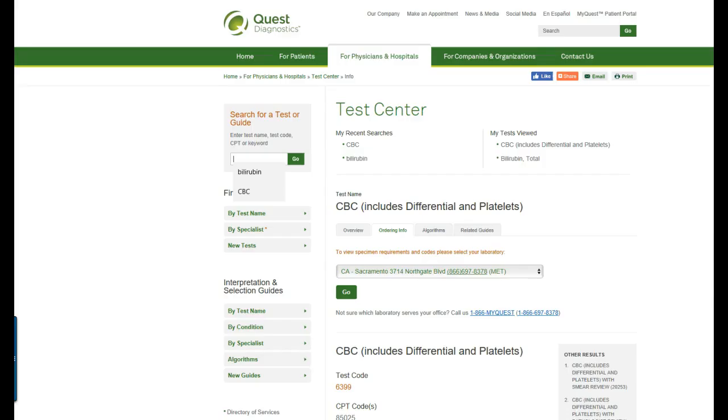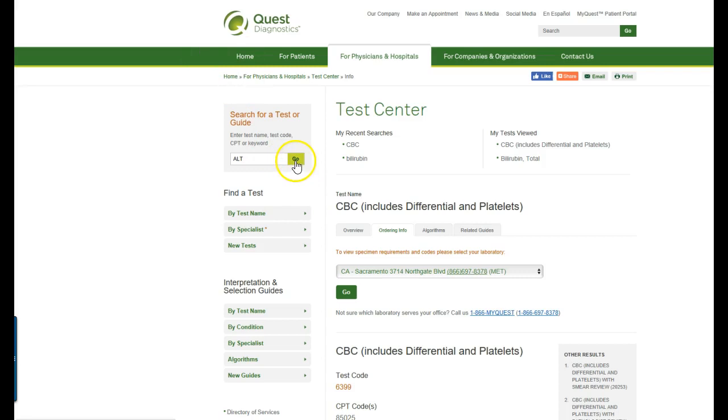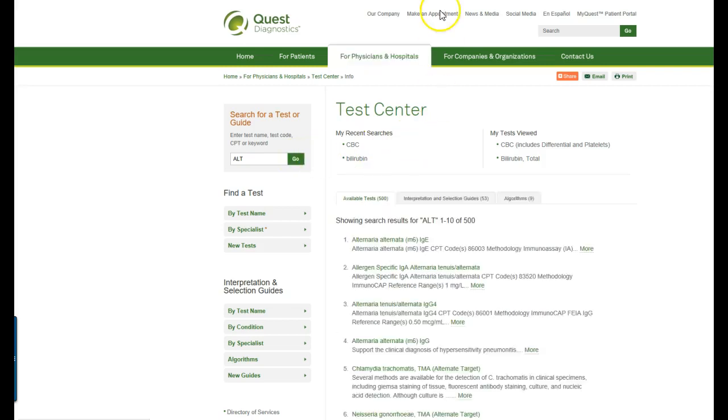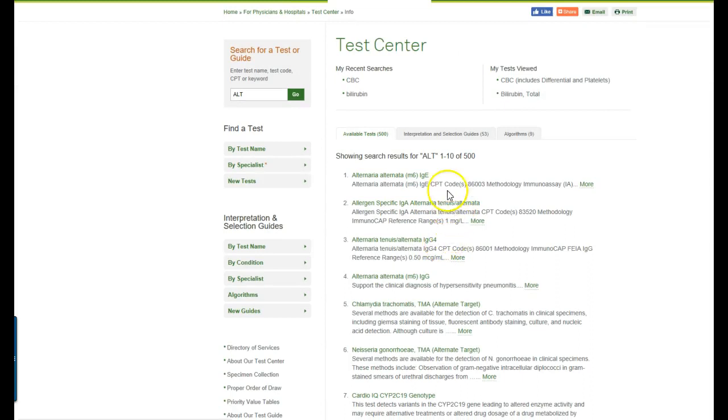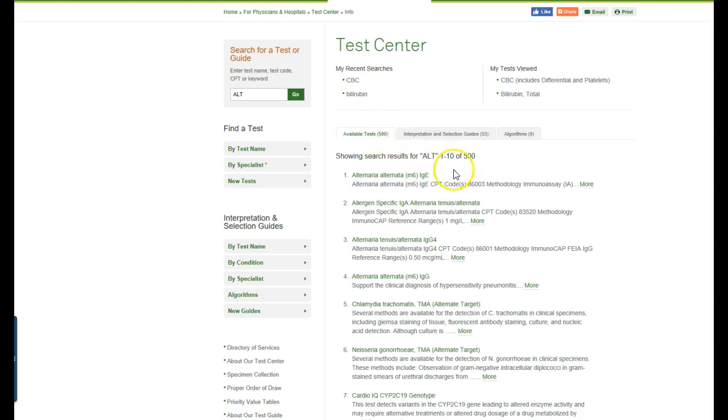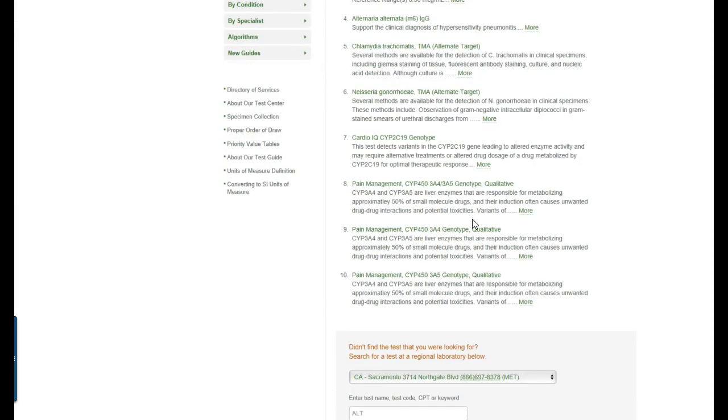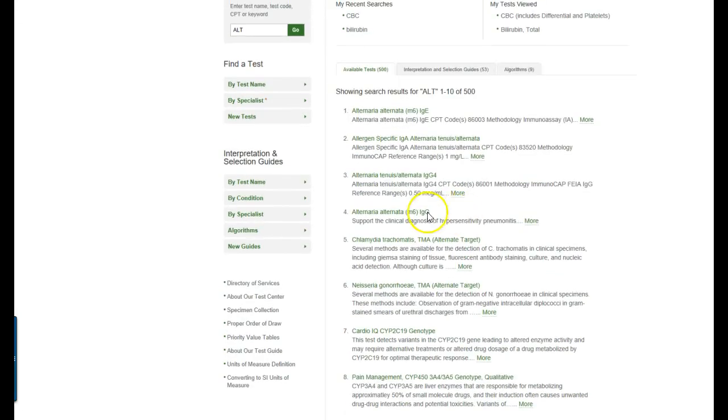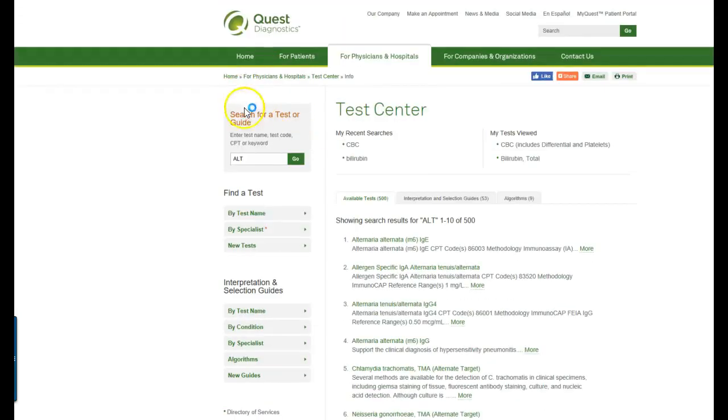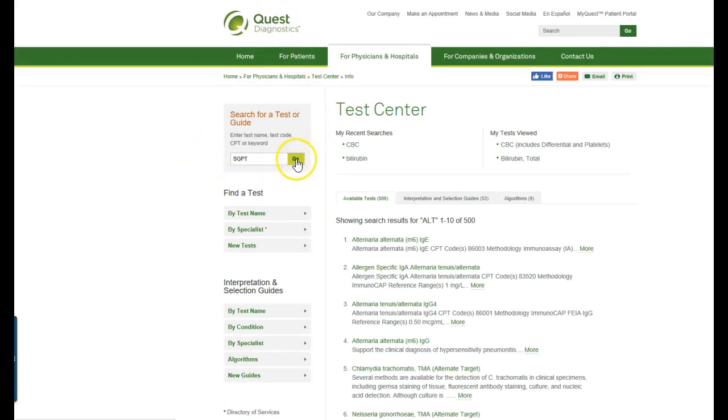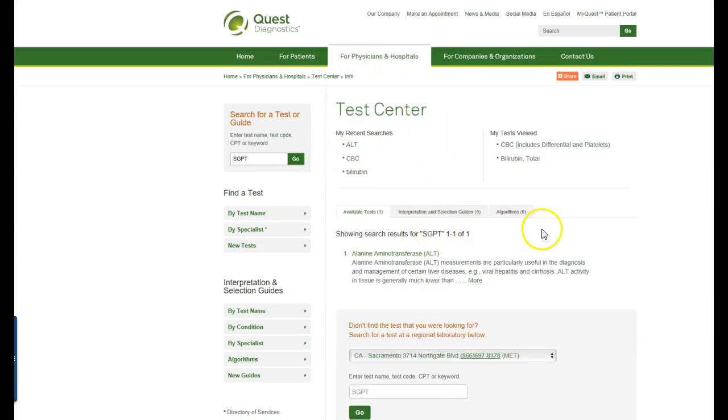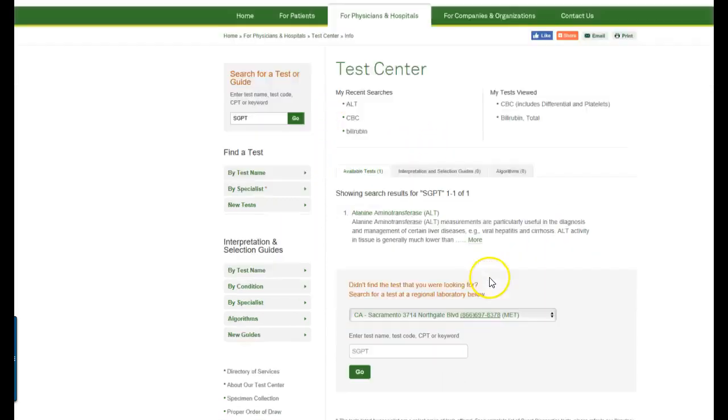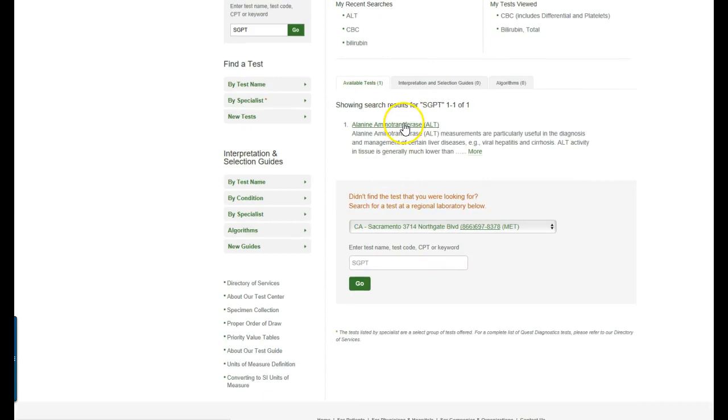So we'll go back over here to the test menu and we will type in ALT. Let's see if it comes up with anything. So we click go. Now you can see that there are a whole lot of things that have the letters ALT in them. There are 500 tests. So in this case since we know the ALT is also known as SGPT we may want to try SGPT.